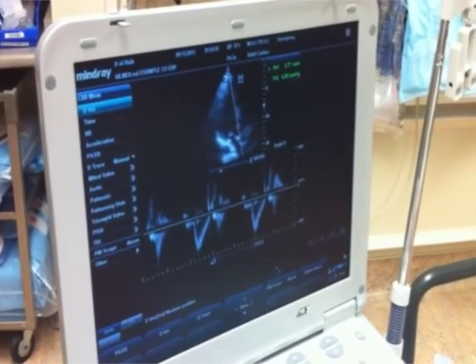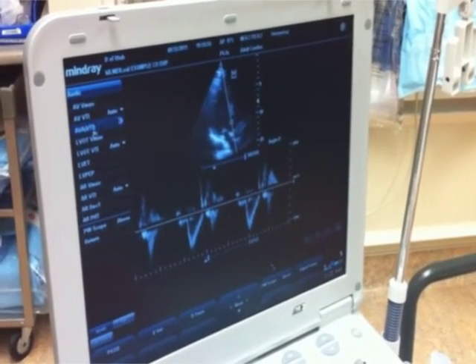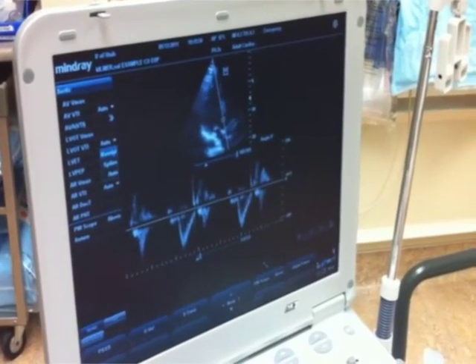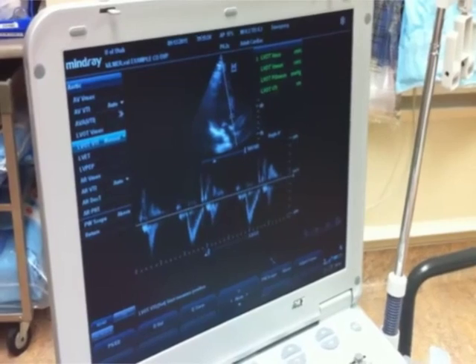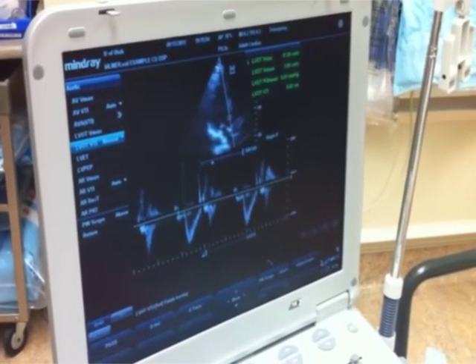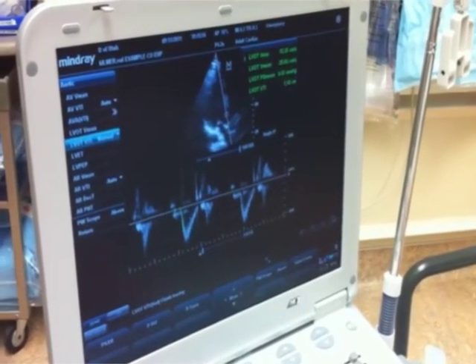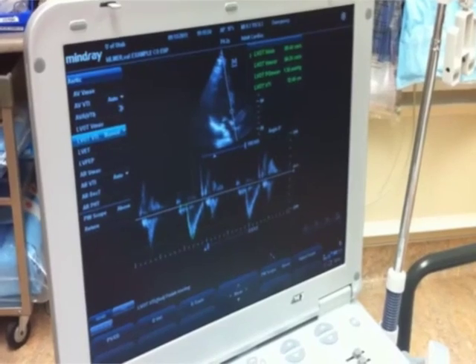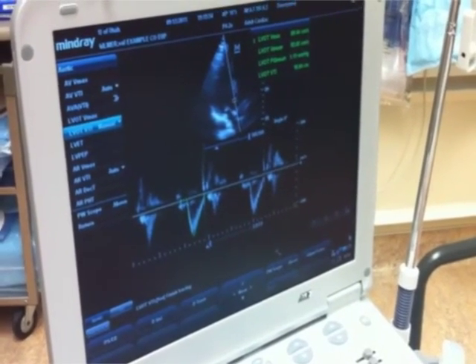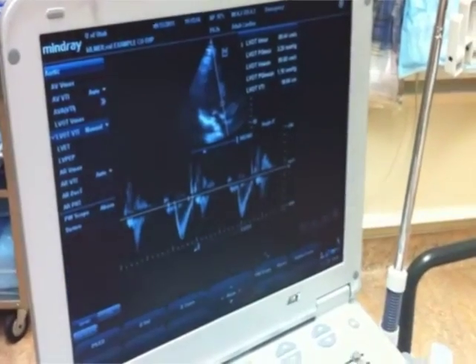I'm going to hit measure again and go over here, and on this particular machine, the LVOT VTI is under aorta. I choose LVOT VTI, manual measurement. What I'm going to do is basically trace that VTI right here, and you can see I'm tracing it with the trackball. Once we have that traced, I hit set again, and it tells me the LVOT VTI is 18.84 centimeters.